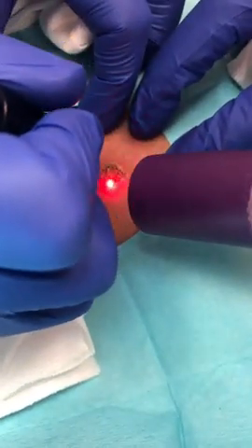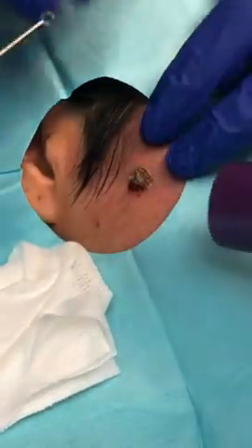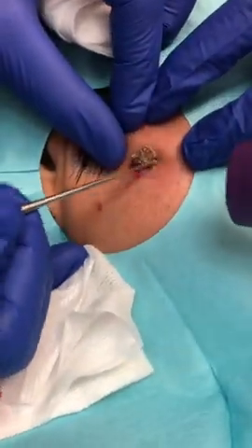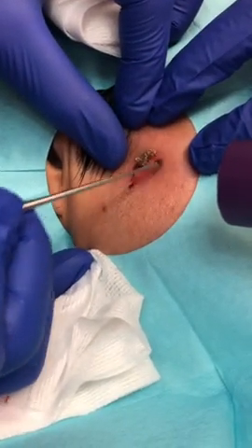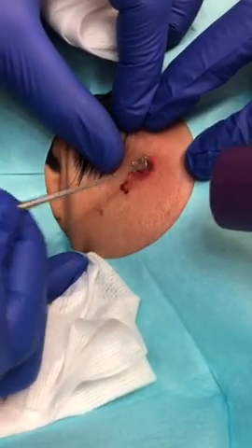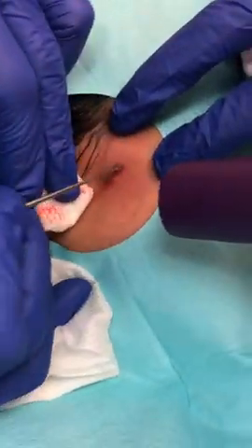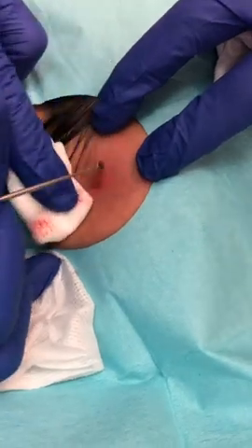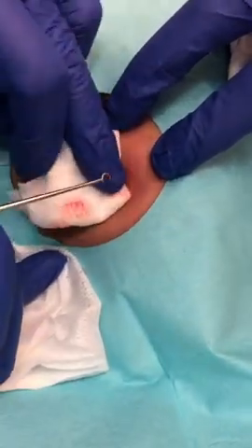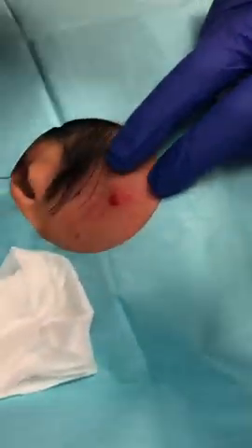The nice thing about this laser is that I can control the depth of penetration precisely so that I can eliminate the skin lesion without causing any injury to the deeper skin layers. Less collateral damage typically means less scar tissue and overall better outcome.